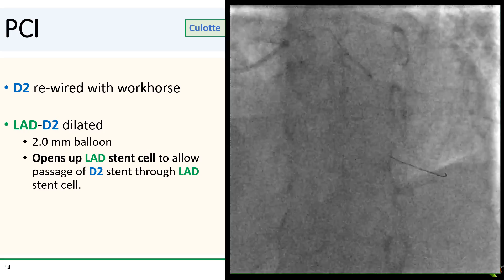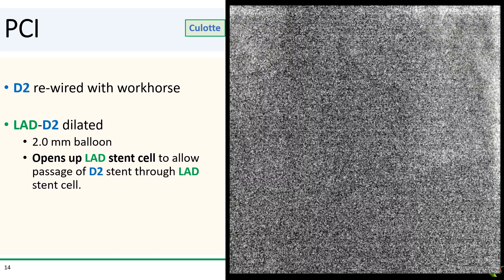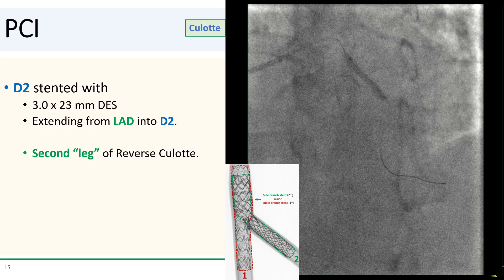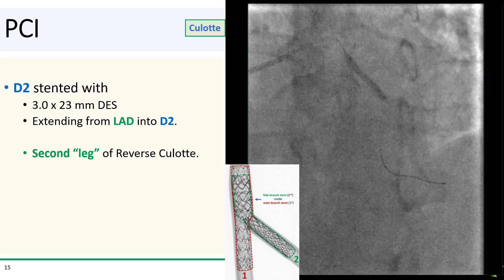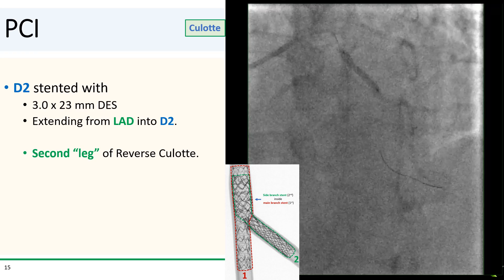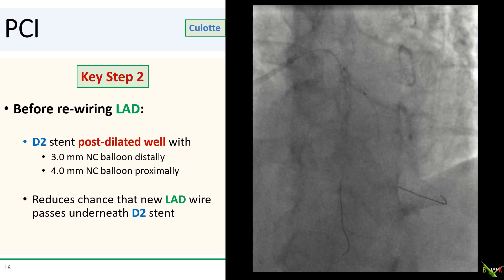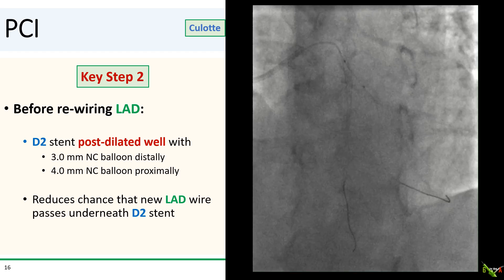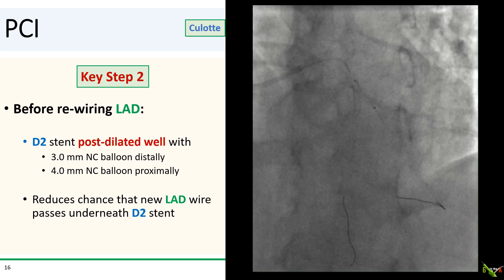We then used a 2.0 mm balloon to dilate the LAD into D2. This step opens up the LAD stent cell to allow easier passage of the new stent into D2 through the LAD stent cell. We then stented D2 with a 3.0 by 23 mm DES extending from the LAD into D2. This stent is therefore concentrically inside the LAD stent and forms the second leg of the reverse culotte. We've also just jailed the LAD. Before rewiring the LAD, we make sure the D2 stent is post-dilated extremely well with 3.0 and 4.0 mm NC balloons, which reduces the chance that the new LAD wire will pass underneath the D2 stent.